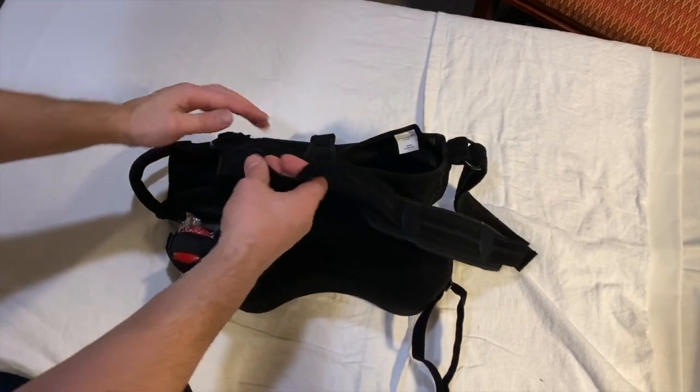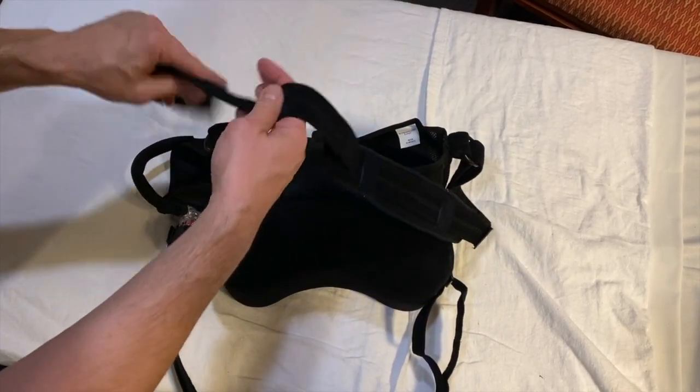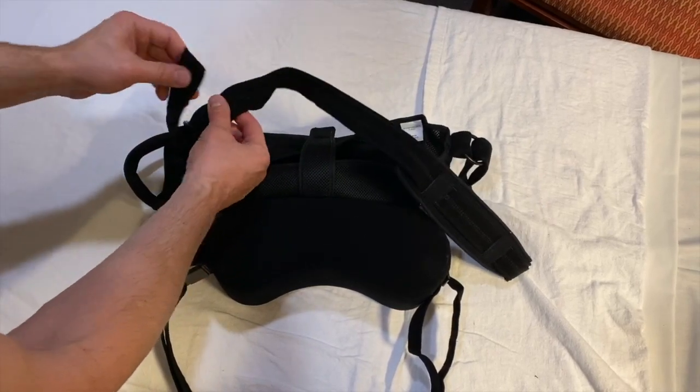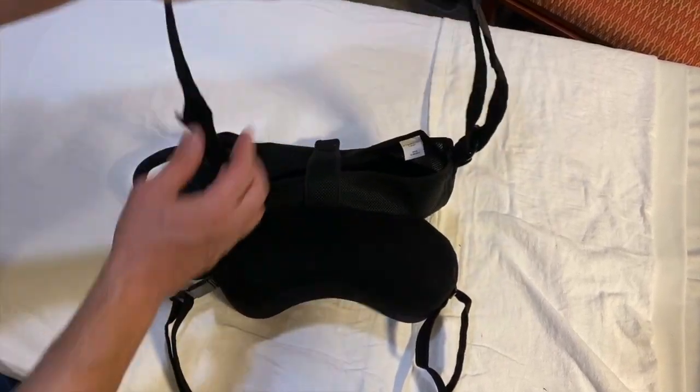The first thing I would say is if you take your sling off and just kind of look at it, there's a bunch of straps. Each strap on the shoulder harness has Velcro that can make it tighter for you.